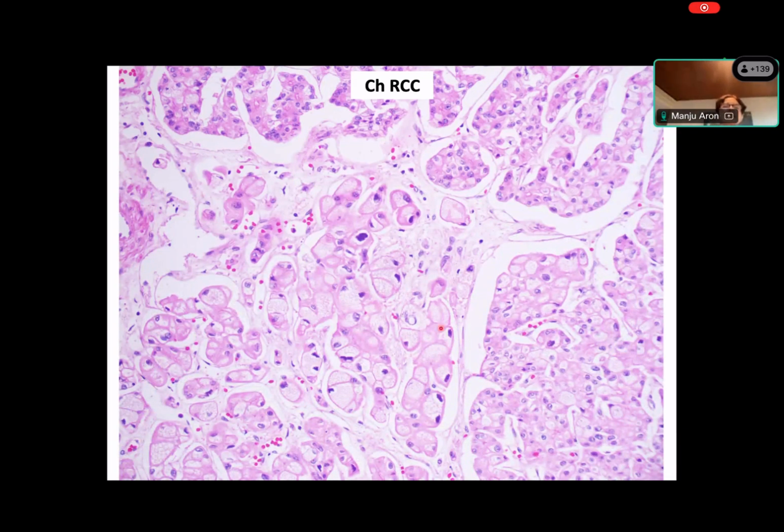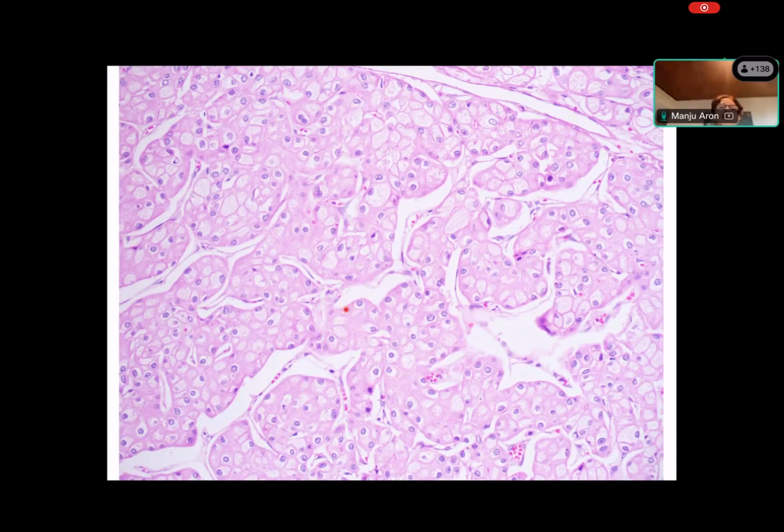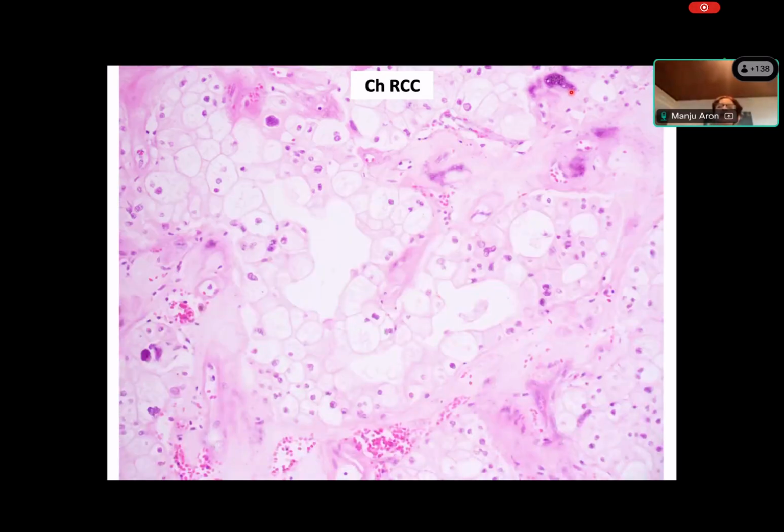Now, here's a case of a chromophobe RCC. Chromophobe RCCs are characterized by clear to pink cytoplasm, and they have this typical koilocytotic kind of nuclei, right? Very well defined cytoplasmic membranes, almost like plant cell-like. So that's very characteristic of chromophobe RCC. Here's another example where the nuclear features are not very well developed, but you can see there are these perinuclear halos, because here the cytoplasm is a little bit more pink. And sometimes you can see areas of calcification.